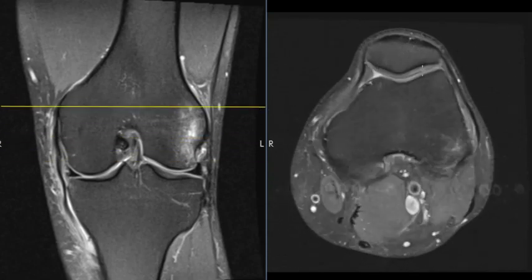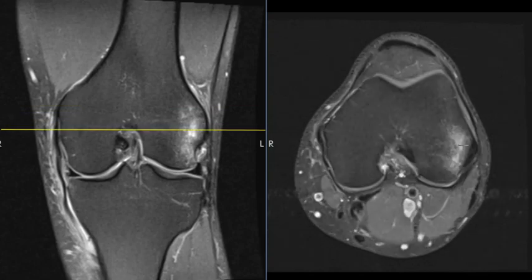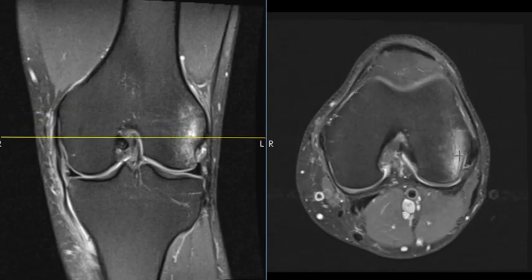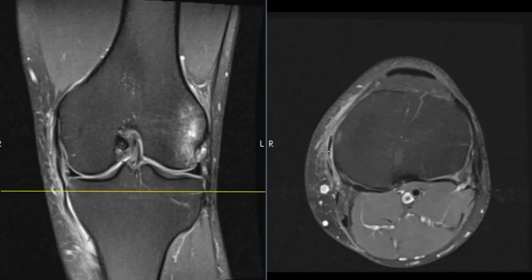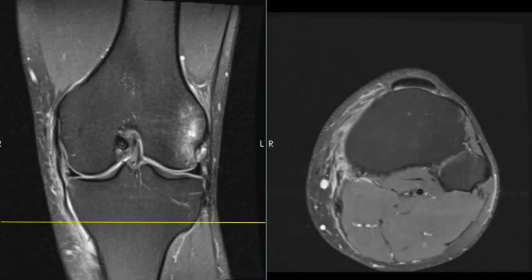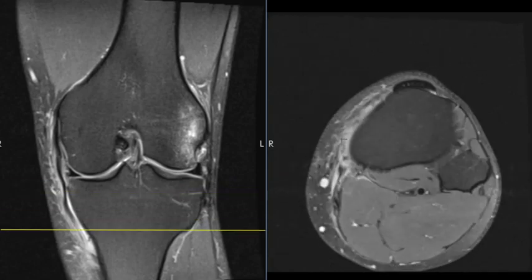On this axial view we can see the kneecap up front looking great; we can see the cartilage over the rim. Here we see that patchy marrow edema over the lateral femur, and over on the inner side is where we have that torn medial collateral ligament.